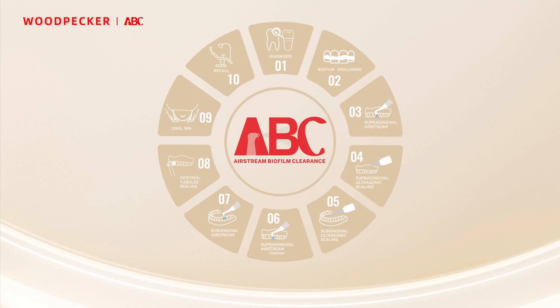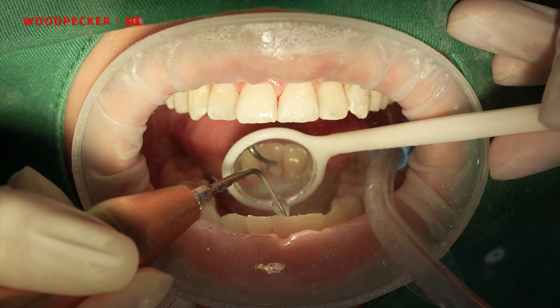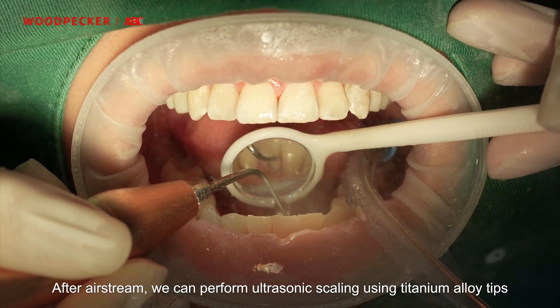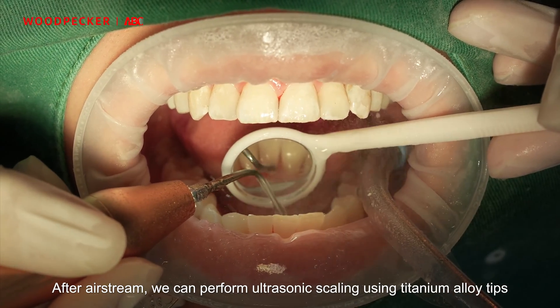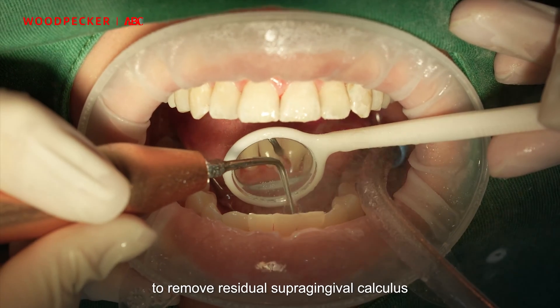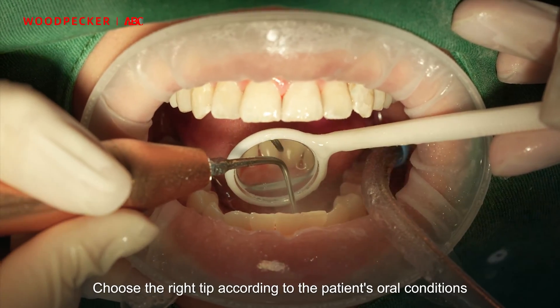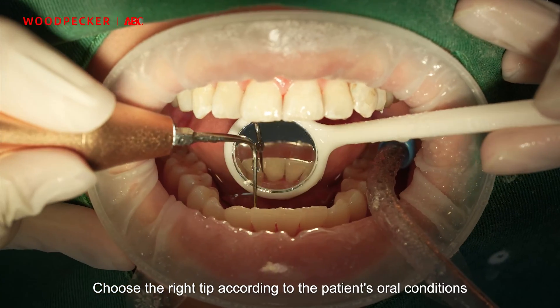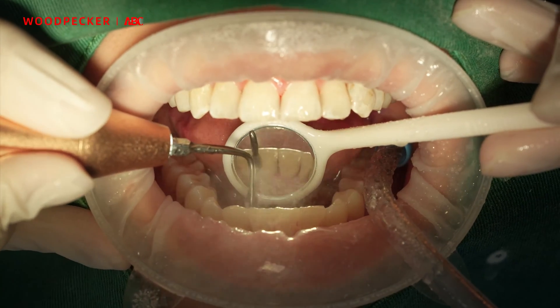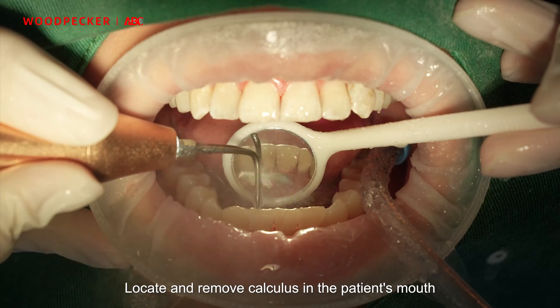Step 4: Supragingival Ultrasonic Scaling. After Airstream, we can perform ultrasonic scaling using titanium alloy tips to remove residual supragingival calculus. Choose the right tip according to the patient's oral conditions. Locate and remove calculus in the patient's mouth.